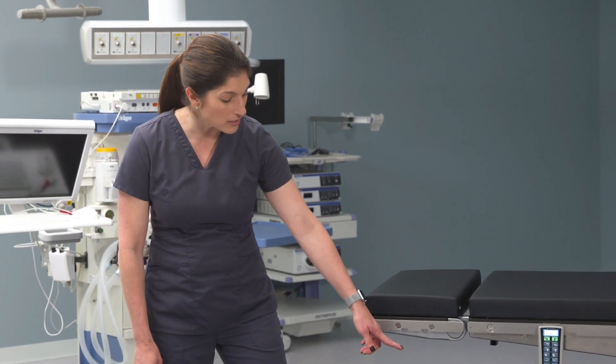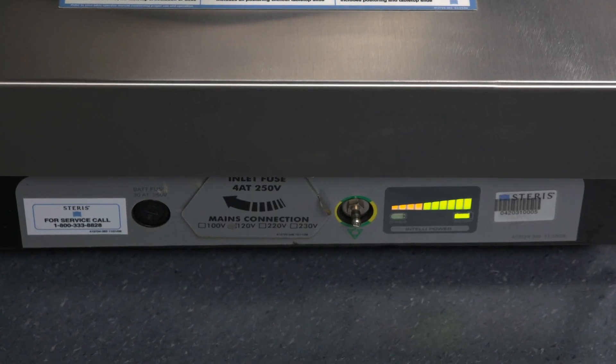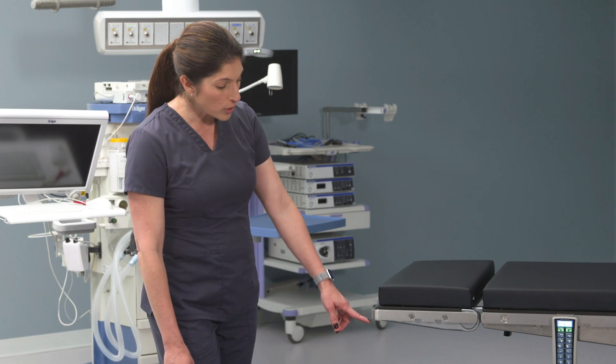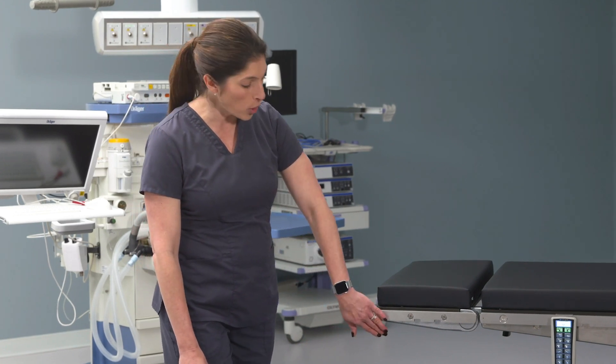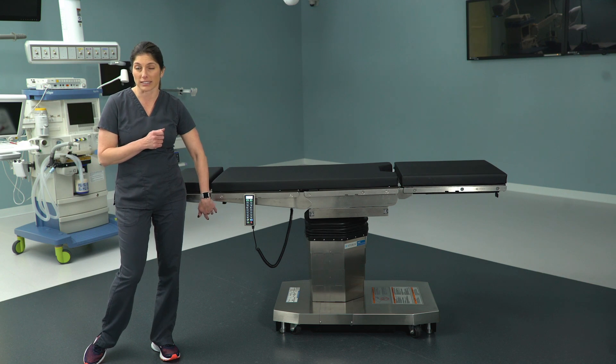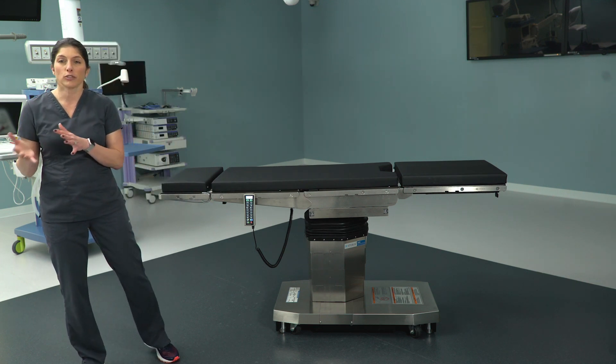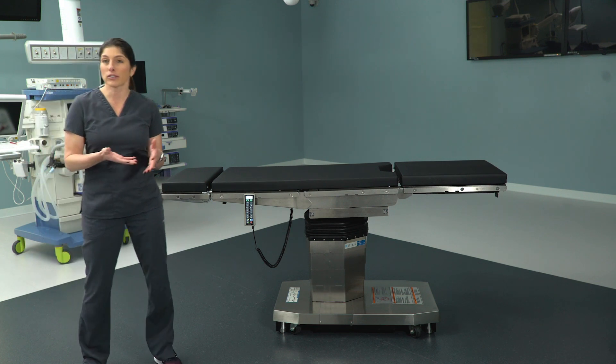If you take a look at the base up here near anesthesia, you'll see a couple of things to take notice of. First, the battery life indicator — you'll notice it's full right now, full charge. There's also a cover; when you open that up and slide it to the left, there's a place for you to plug in for electrical access.